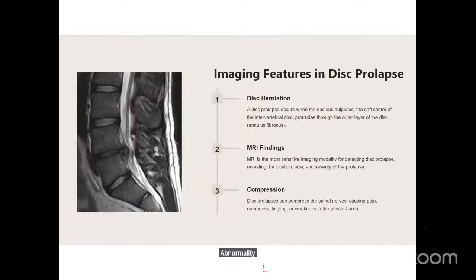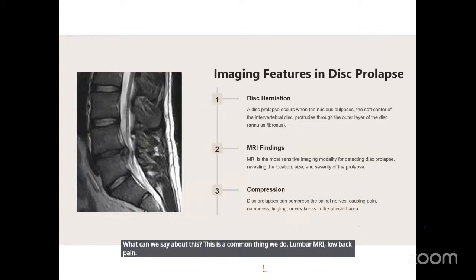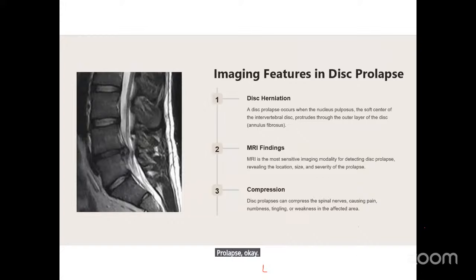Are we together? So we're going to the spine now. What can we say about this? This is a common thing we do. Lumbar MRI, low back pain, prolapse. What can we say about this?